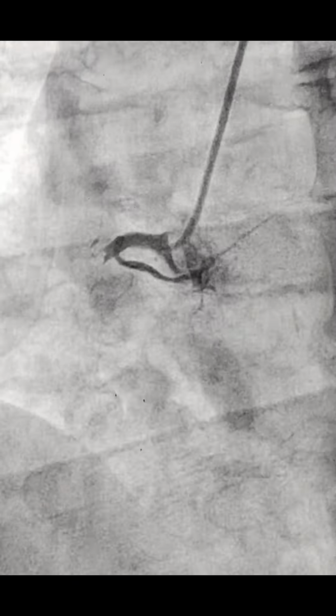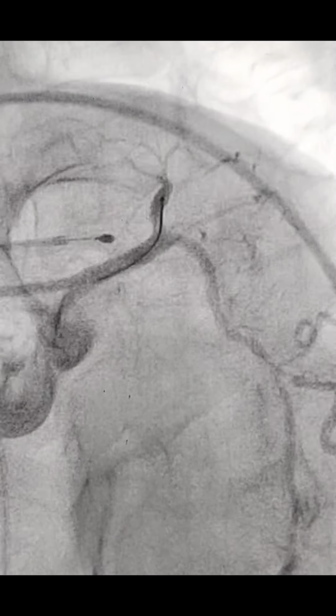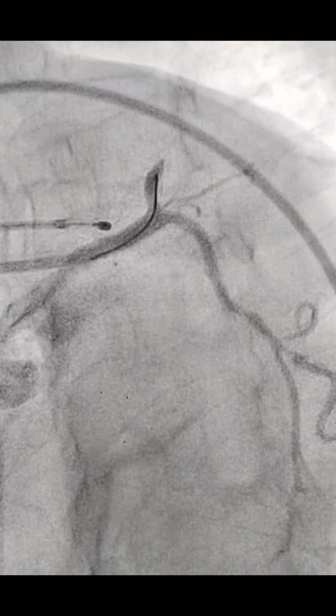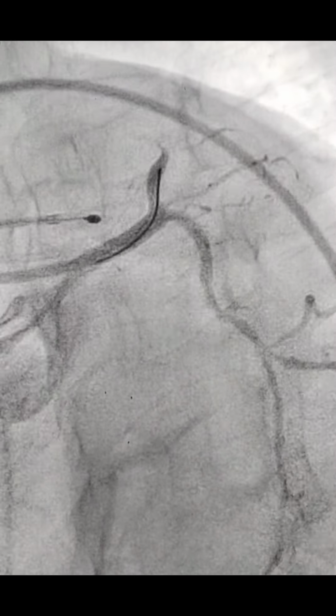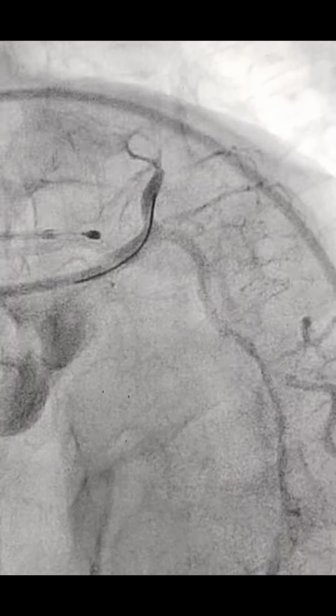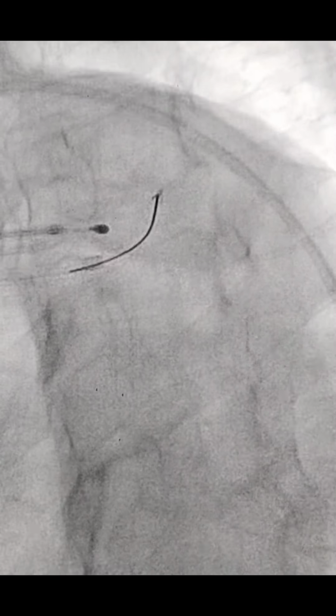So this patient was admitted in the Yojana, which has only 2 stents. The patient has continuous chest pain, so we decided to do angioplasty to the RCA and LAD. Meanwhile, the patient had one episode of VT, and we gave one DC shock with 150 joules, and the patient reverted. And this is the temporary pacemaker lead, you can see under the coverage, because there was an ostioproximal RCA block. And this is the BMW PTCA wire.